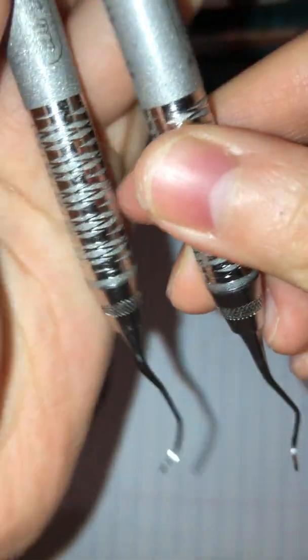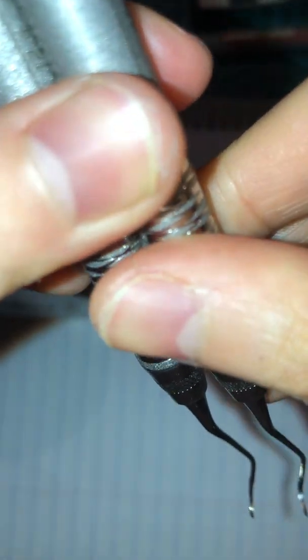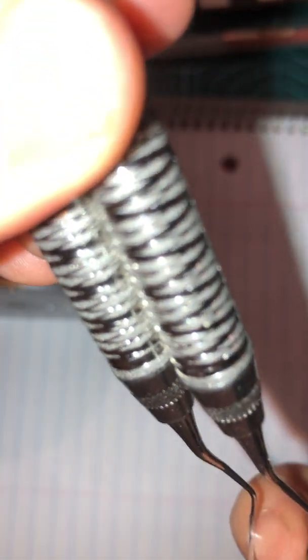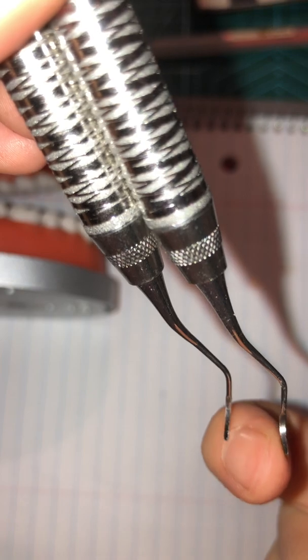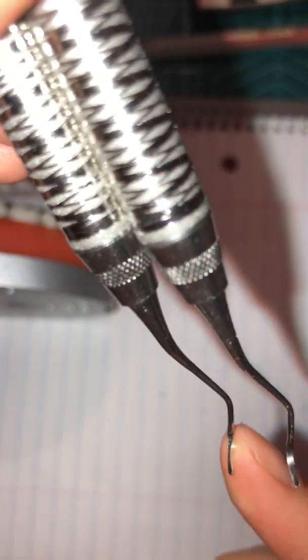So now when you put it together, you're able to tell that the 13-14, this side is lower, and the 15-16, this side is lower. So obviously when you turn it around, you know which side you're working on, and that's how you can tell the 13-14 and the 15-16.